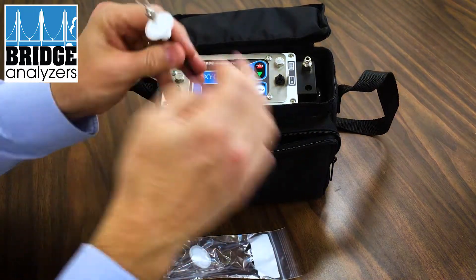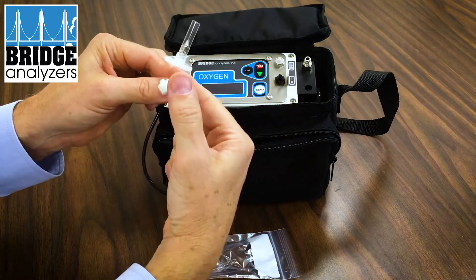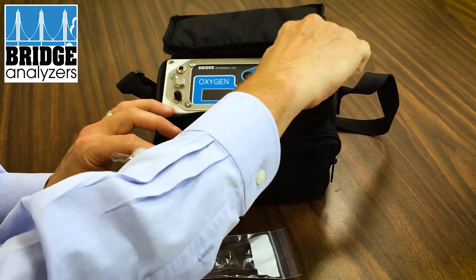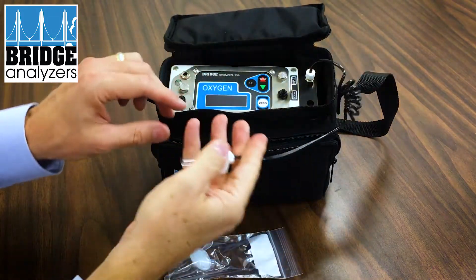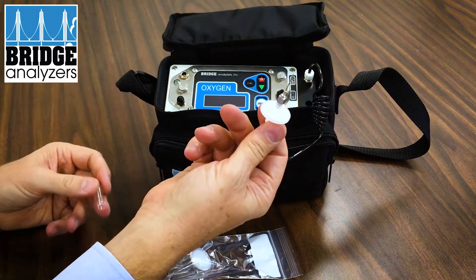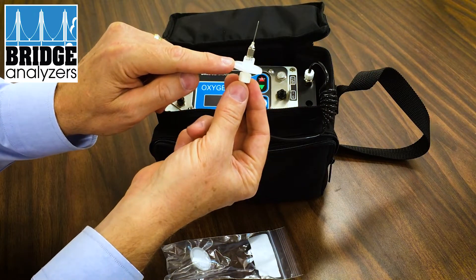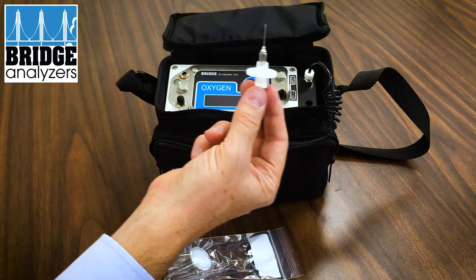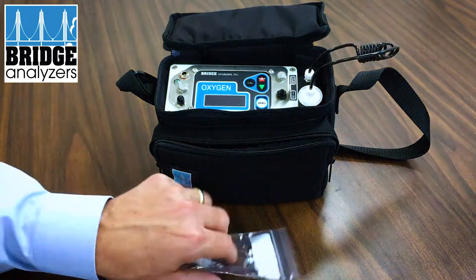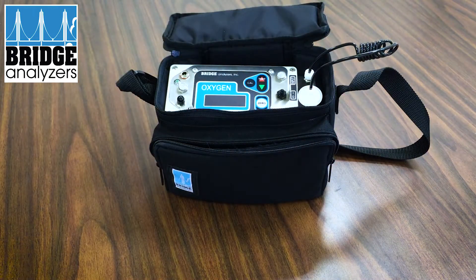Inside the front pocket you'll see the sample line with a filter and a needle. The sample line attaches to this fitting here and it's a manual screw-in. You can pull off the protective cover from the needle, and there's a 25 millimeter filter which filters out particulate and also moisture. This sample assembly fits into a hole, and you'll receive one spare filter for later use.